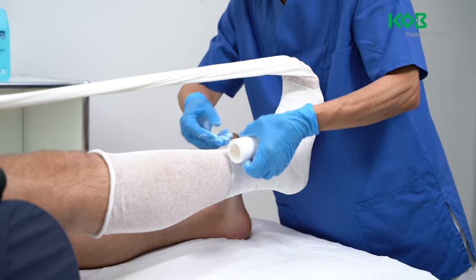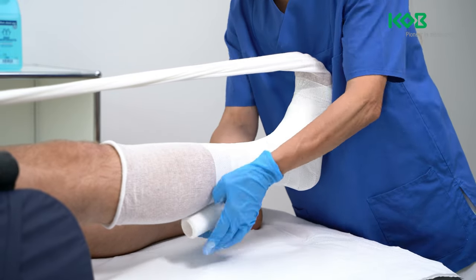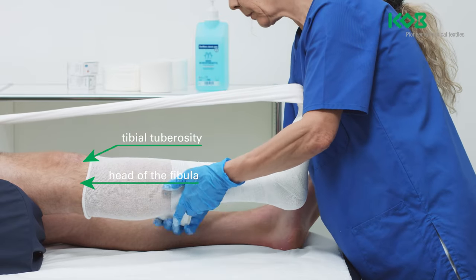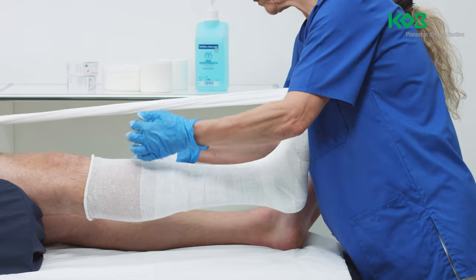Keep the bandage wrinkle-free while wrapping the heel until it covers the heel completely. Then wrap the calf in spiral fashion up to the head of the fibula. The head of the fibula and the tibial tuberosity form the proximal anchor points of the bandage.